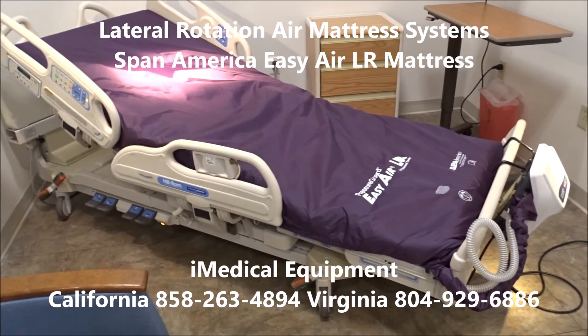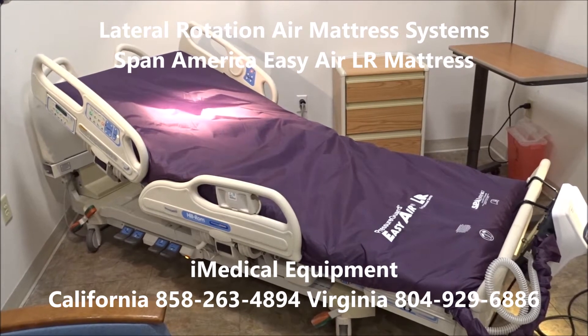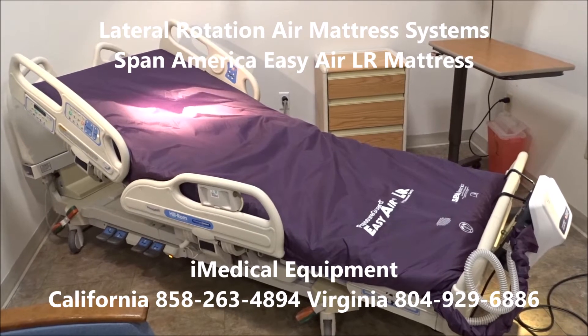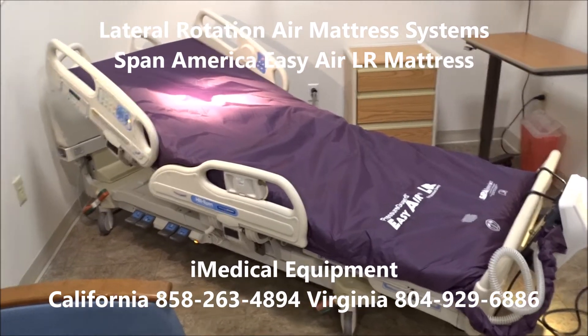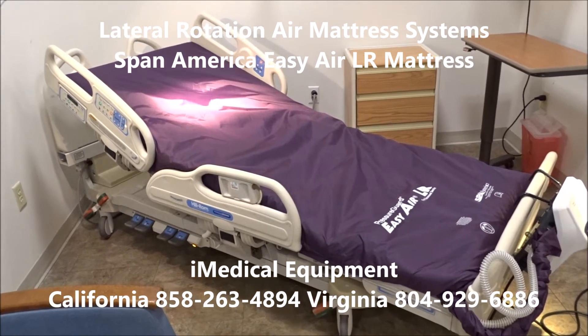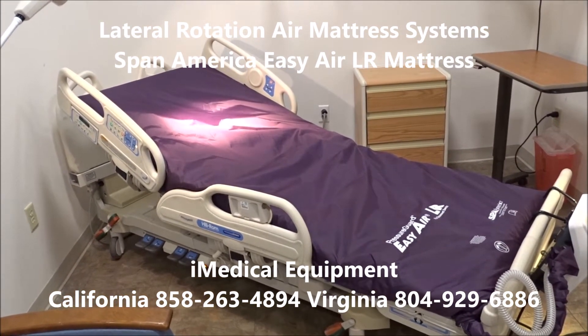This is an excellent choice when it comes to an air system that's going to provide a very high level of quality to treat and prevent bed sores and pressure wounds, combined with a hospital bed that's basically bulletproof and has all the features you need. These beds are used a lot in ICU and hospitals. The Hilrom P3200 VersaCare bed is the best bed we carry that's made by Hilrom.